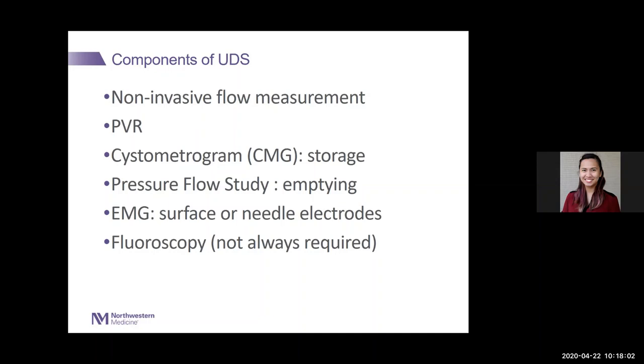There are CMG, which measures the storage phase of the bladder, and then the pressure flow study, which measures emptying. So there's really two main functions of the bladder, storage and emptying, and those are the two things you're going to evaluate with the urodynamics. You also do EMG, surface electrodes typically.